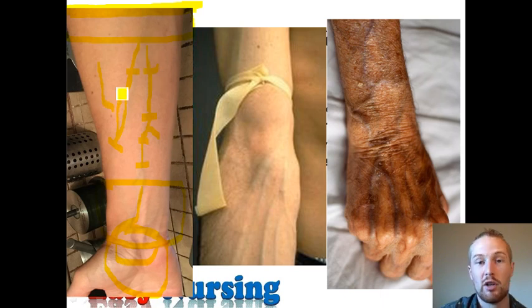Okay, you also have another patient's arm. So let's look at this one. This is one that you can palpate. We can't really see the color, but we can definitely see and feel. Don't start on the AC. Probably don't want to start any closer than about an inch and a half from the AC. So anywhere from here up, preferably lower.